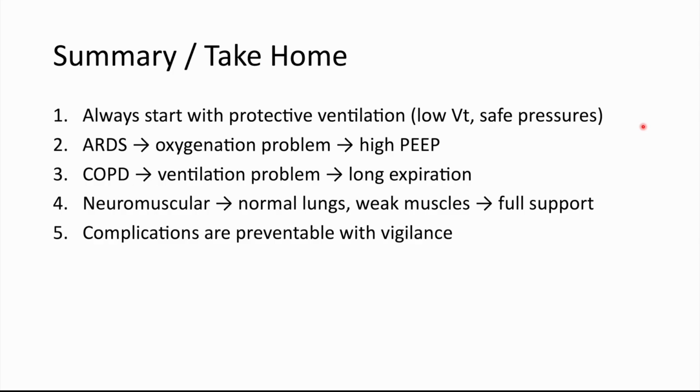Neuromuscular, normal lungs, only weak muscles, so full support is given. Complications are preventable with vigilance. Liberation requires daily assessment, spontaneous breathing trials, and sometimes T-tube testing. ECMO is the ultimate rescue, used only in specialized centers. I told you about ECMO.